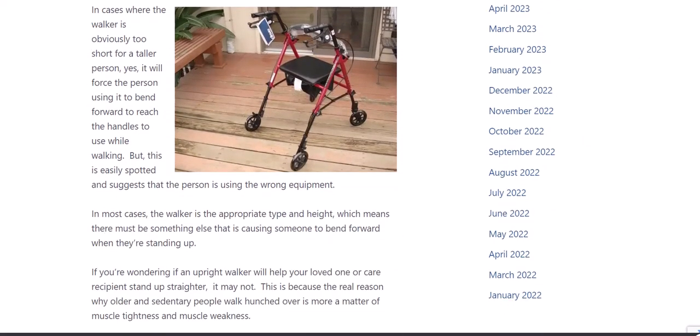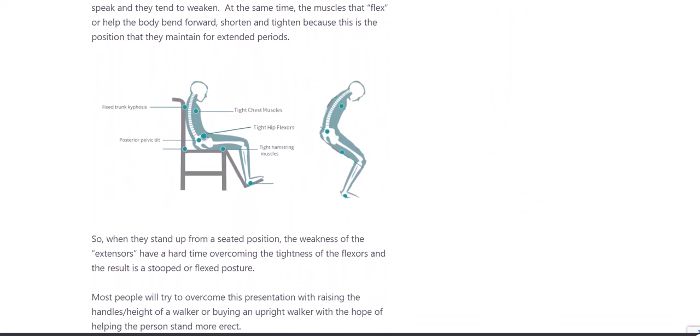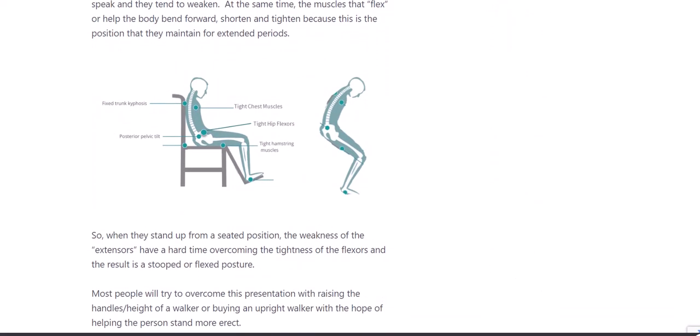As you go down through this blog post, you'll see I have a little diagram here of what happens when a person sits down in a wheelchair for a long period of time, or in any chair for a long period of time. What happens is their spine tends to flex. They flex at the hip, and they also flex at the knee.